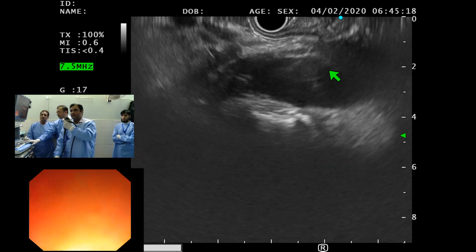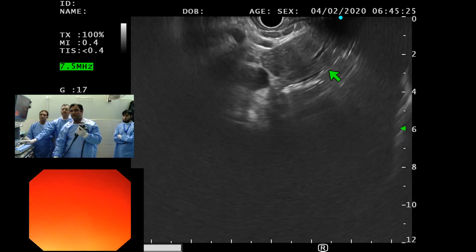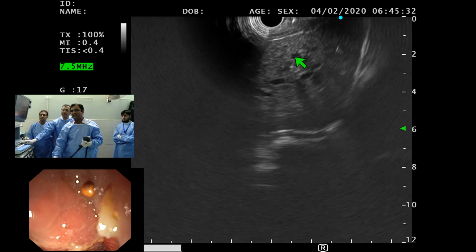Were you able to see the abscesses in the liver parenchyma? Shafkat bhai, did you see any abscesses? Not really up till now. But then the periportal accentuation is there.